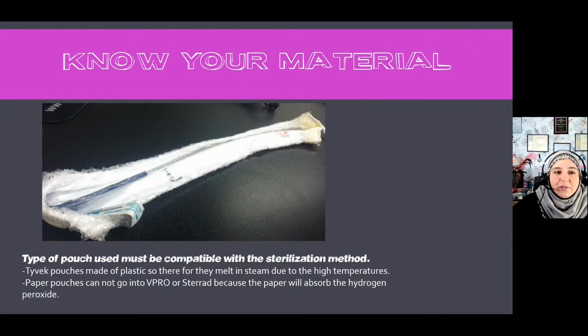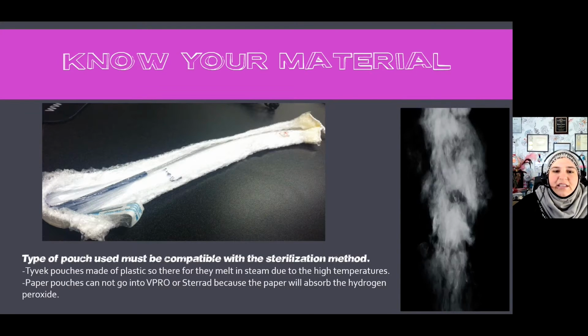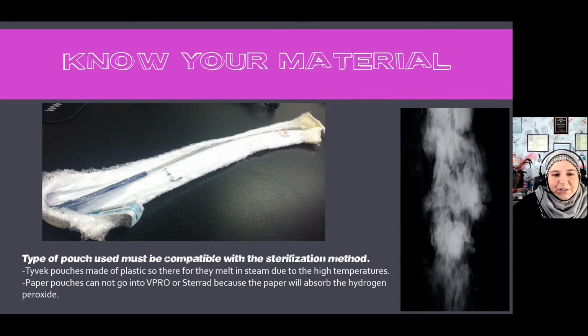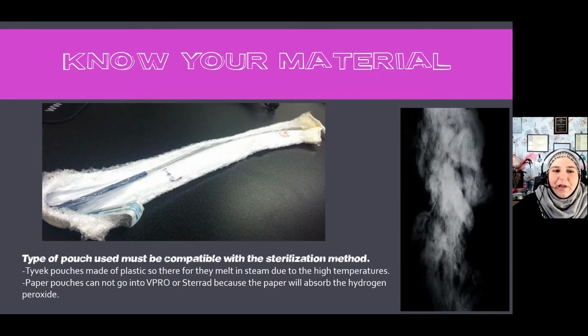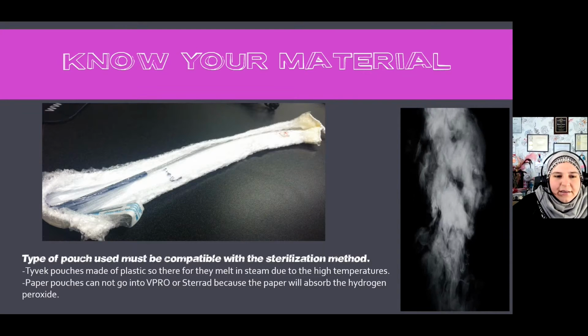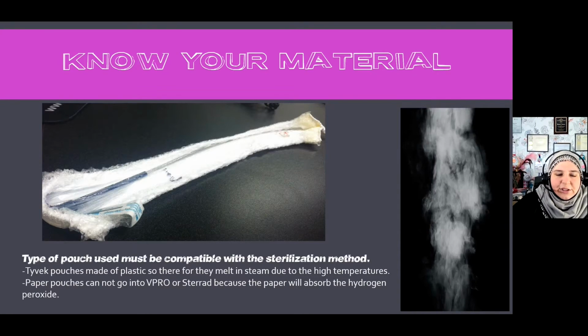So when we talk about pouches, one of the key things you need to remember is to know your material, right? So we want to make sure that we know what our pouch material is in comparison to what type of sterilization we're doing. Because if we take this pouch, which was a Tyvek pouch, and we put it into steam, which is what we did, not intentionally, but mind you, it happened. So it got put into steam, and you can see it kind of did that little shrink-a-dink concept, right? So it just completely sealed around the item and the instrument.